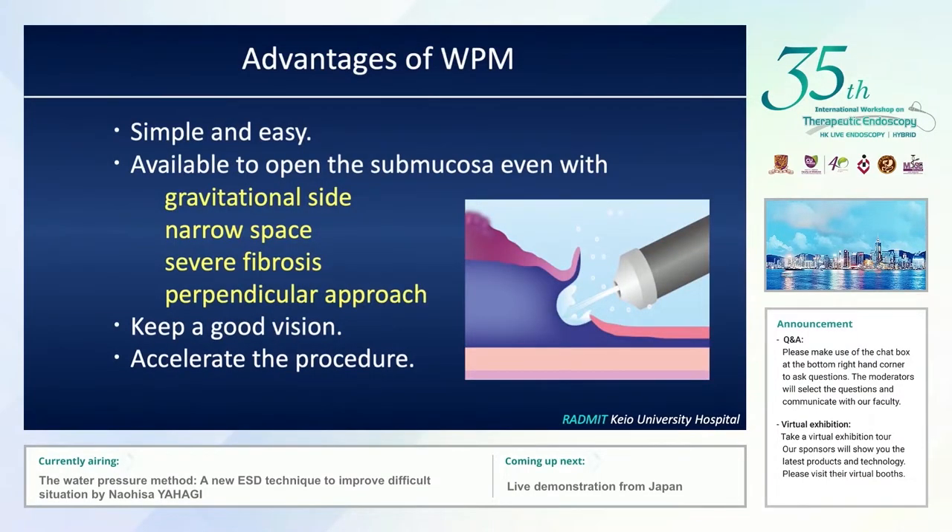There are many advantages of the water pressure method. First, it is simple and easy. Second, it is able to open the submucosal space even in difficult situations such as the gravitational side, narrow space, severe fibrosis, and perpendicular approach — all challenging situations for ESD. It also maintains good vision by avoiding light reflection and smoky effects, and of course it can accelerate the procedure.